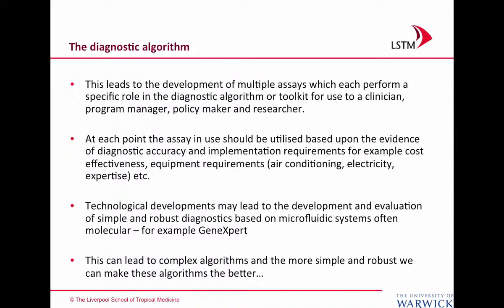At each point in each assay, the implementation should be based on evidence. Frequently it is not. And implementation requirements are often a neglected part of development of a diagnostic tool. So we really have to think about cost effectiveness, equipment requirements in terms of air conditioning, electricity, expertise, training required, and technological developments that may lead to the development and evaluation of simple tests, which are more frequently now molecular.